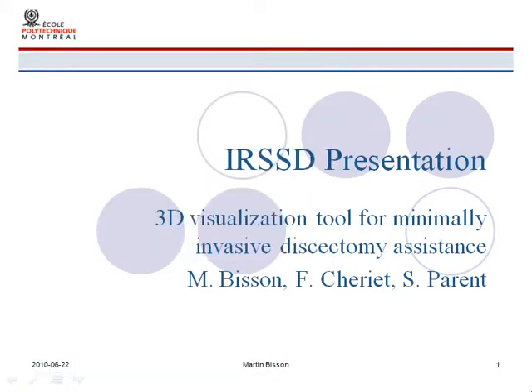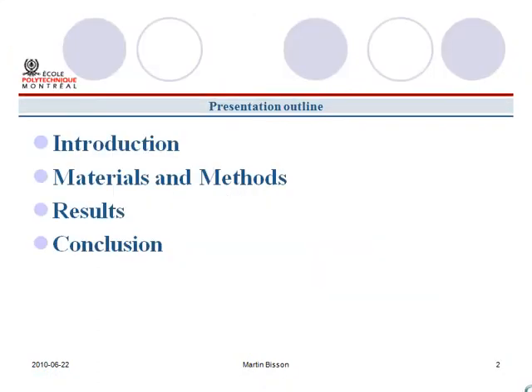Hi, my name is Martin Bisson, and today the title of my presentation is 3D Visualization Tool for Minimally Invasive Discectomy Assistance. I will first give a brief introduction to put you in the context of minimally invasive surgeries. Then I'll present the materials and methods we use to develop our system. I'll present the results we obtained and conclude by making recommendations for future work.